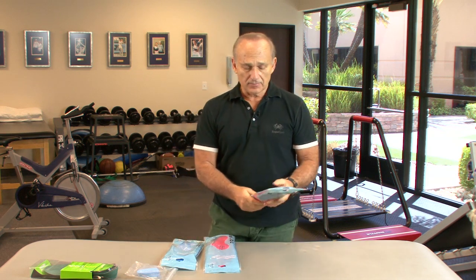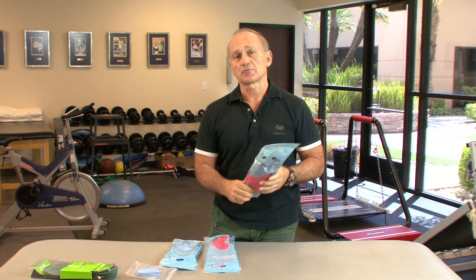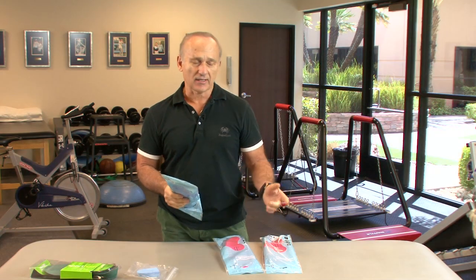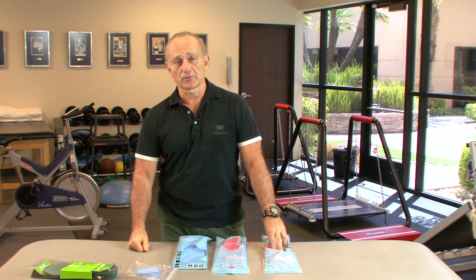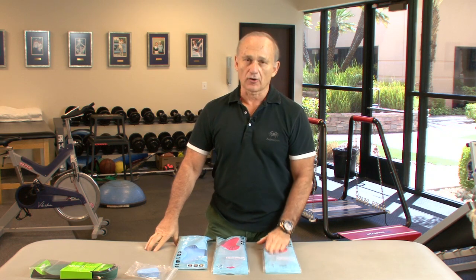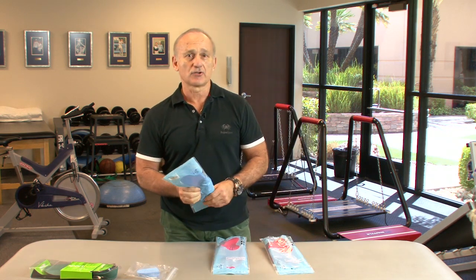So this kind of hard, firm orthotic I really choose for those patients that are really aggressive athletes. Whereas the medium might be for someone who doesn't weigh quite as much, because I get guys in here that are 6'8" basketball players. We work with a company here in Vegas called Impact Basketball Academy, and those guys I really tend to lean towards this hard, firm orthotic. The medium density is also good.